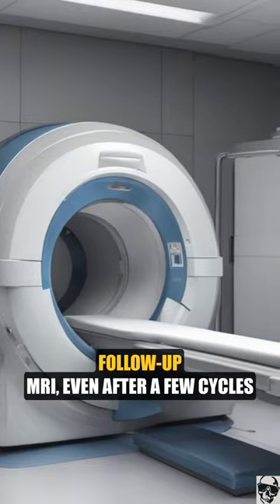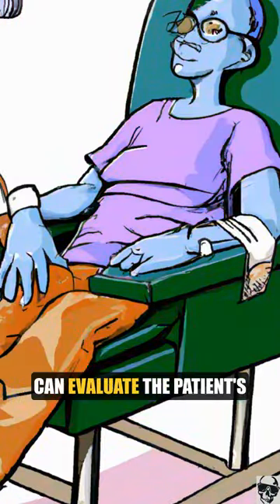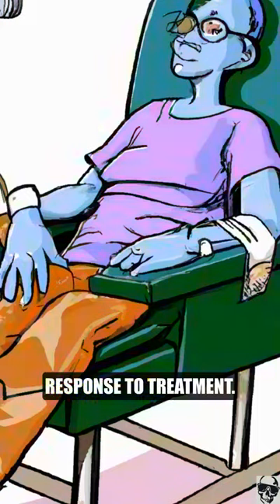Follow-up MRI, even after a few cycles of chemotherapy, can evaluate the patient's response to treatment. This is 60 Second Radiology.